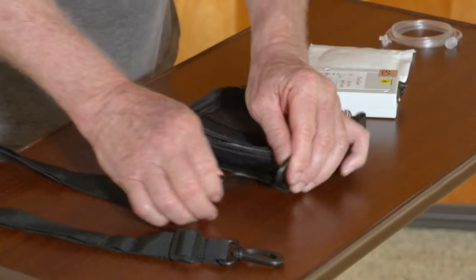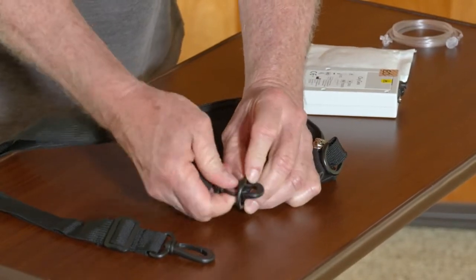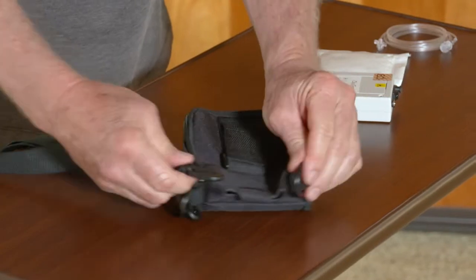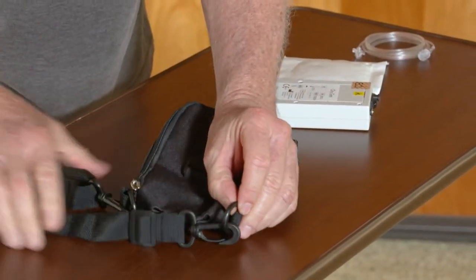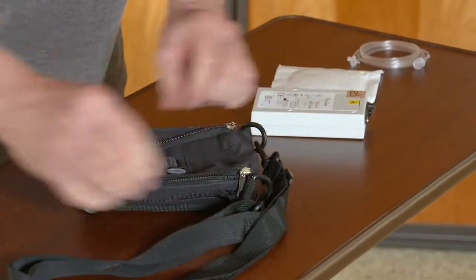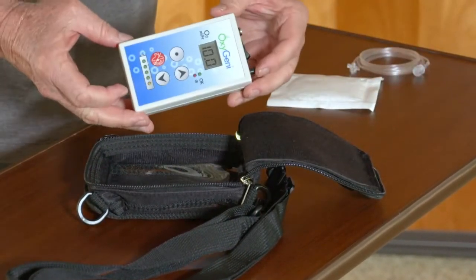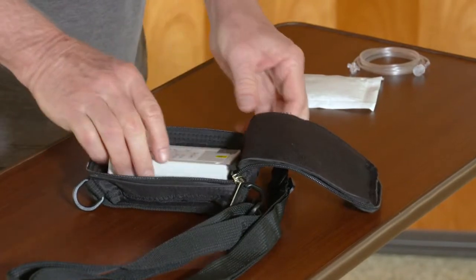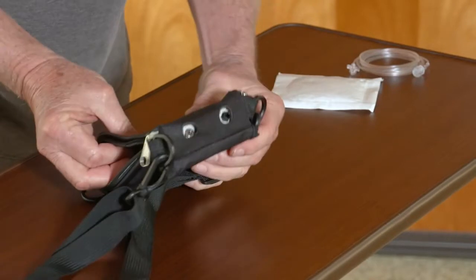Remove the strap from inside and attach it by clipping both ends of the strap onto the case. Place the Oxygeni inside the carrying case face down, with the front side facing the clear panel.